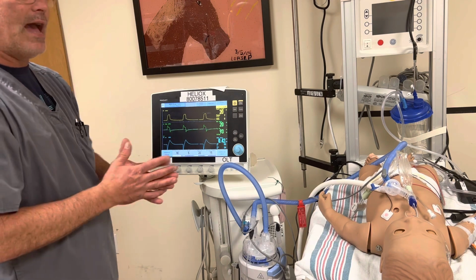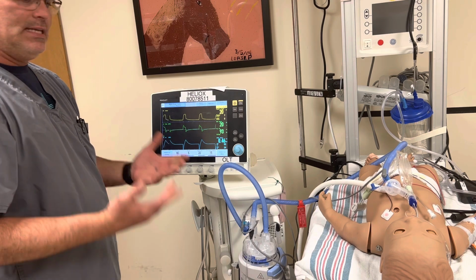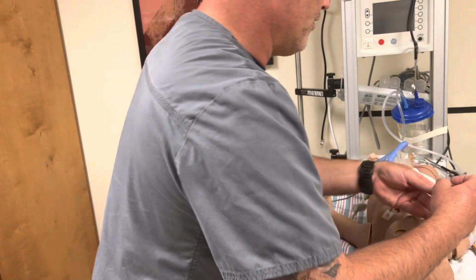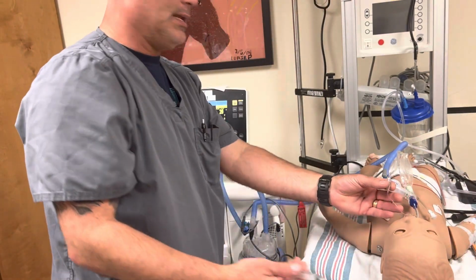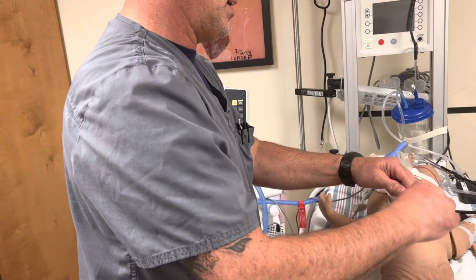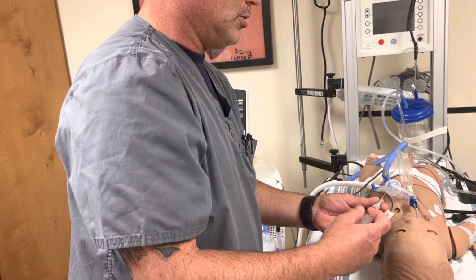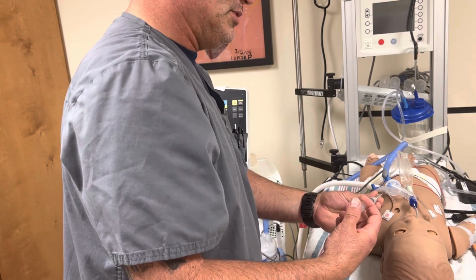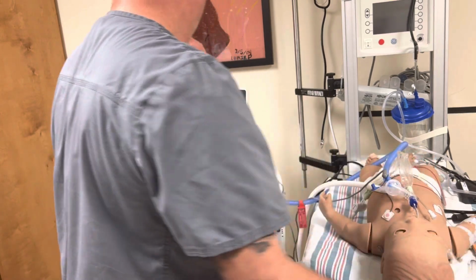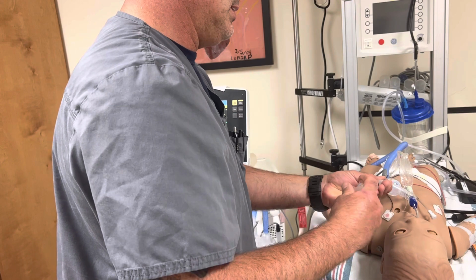So I immediately have to figure out, is it a correctable leak or is it a leak the patient is going to have? So on this situation, I look at the kid, I come over here and I notice he had a cuff tube. We intubated him with a cuff tube, so I know there shouldn't be a leak from that area. So I'm going to come in and I'm going to listen. I hear a leak over the trachea, so that means I'm going to inflate my cuff until that goes away. That would be our minimal occlusion policy. And then I would come back and I would look at my vent and see, is that leak gone?